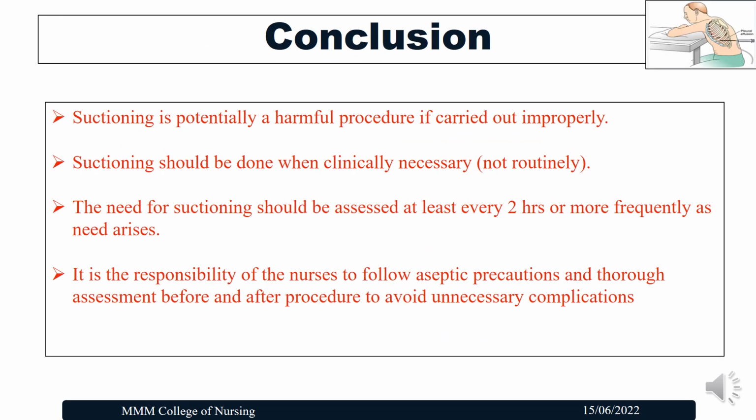To conclude, suctioning is a potentially harmful procedure if carried out improperly. Suctioning should be done when clinically necessary. It is not a routine procedure. The need for suctioning should be assessed at least every 2 hours or more frequently as need arises. It is the responsibility of the nurses to follow aseptic precautions and thorough assessment before and after the procedure to avoid unnecessary complications.